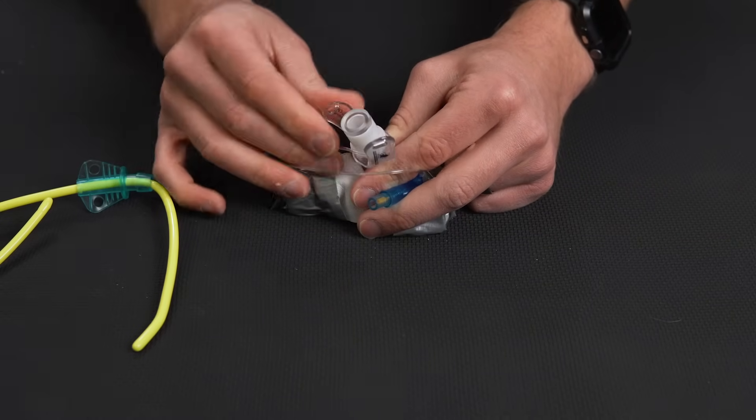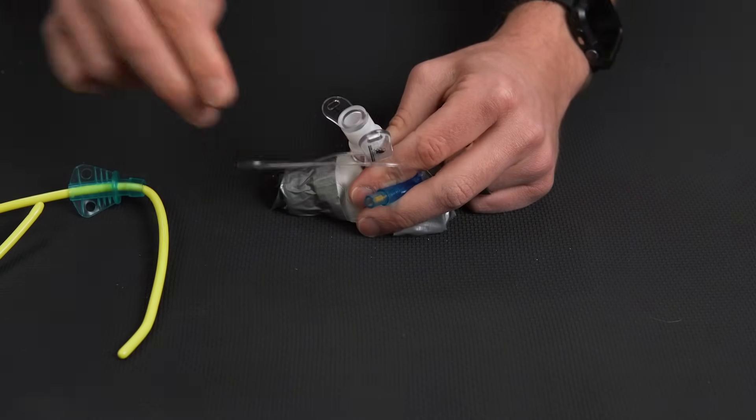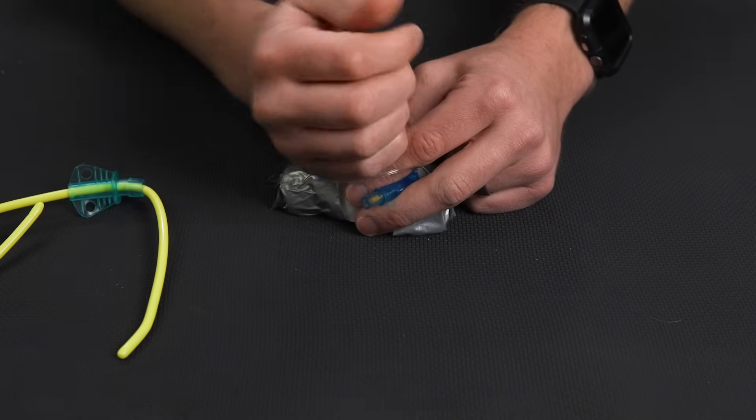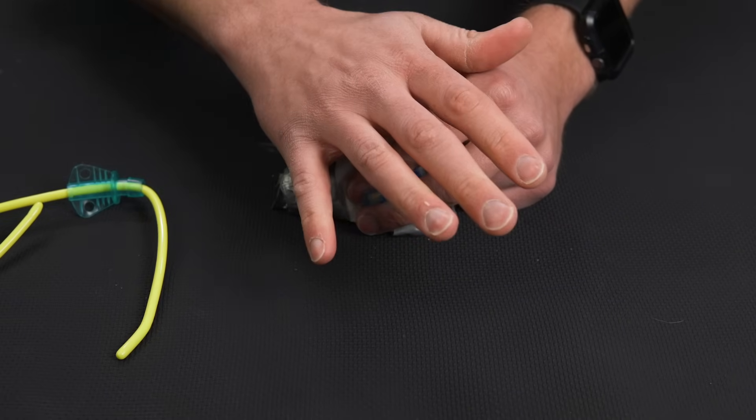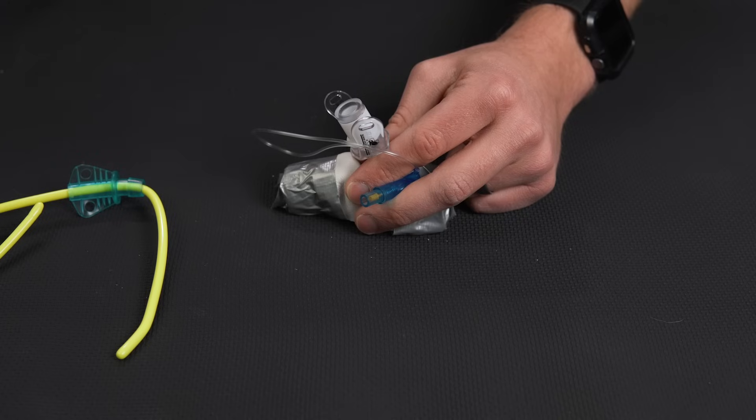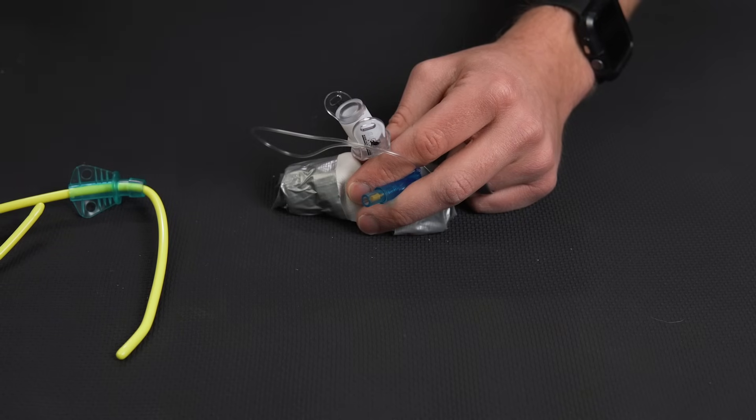Once we have that, we confirm it the exact same way we would an endotracheal tube. We want to put capnography on that. We're going to take a bag valve mask, start ventilating the patient, and we're going to listen to lung sounds and we're going to listen for the absence of epigastric sounds.